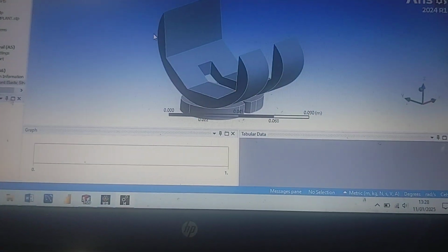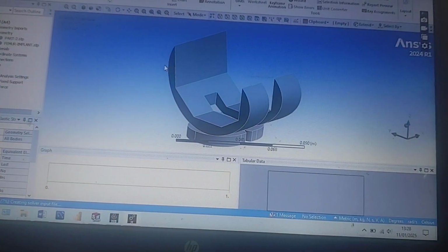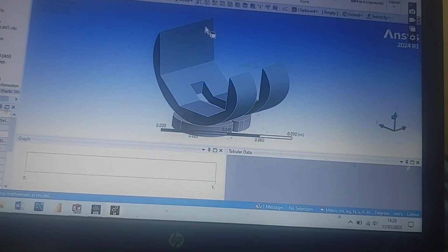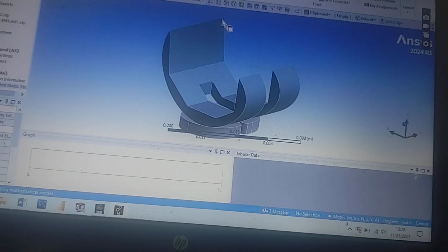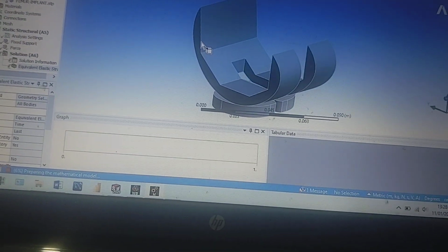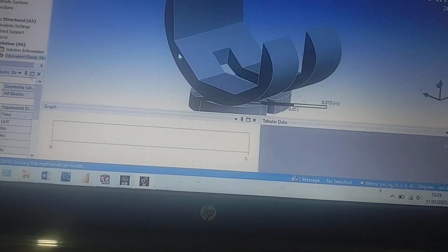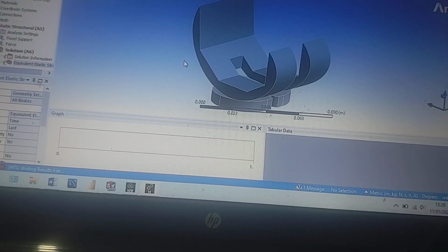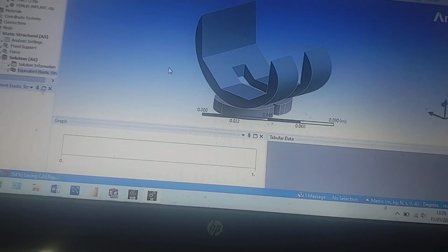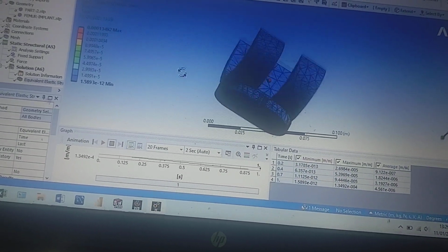Based on your computer's processor and hard drive, this will take a few seconds or up to a few minutes. Then it will show how the stresses will generate in the orthopedic implant by using this femur material. I will tell you about the biomaterials in another video later, but there are mainly three biomaterials used in this field. This is a beautiful stress graph.